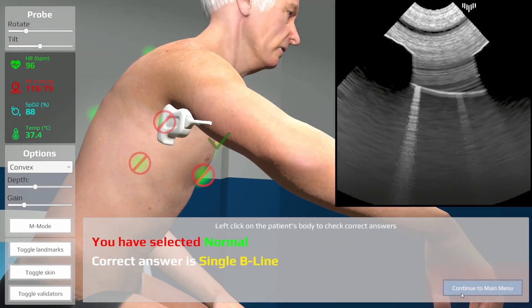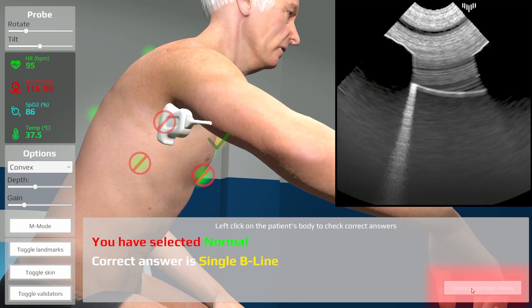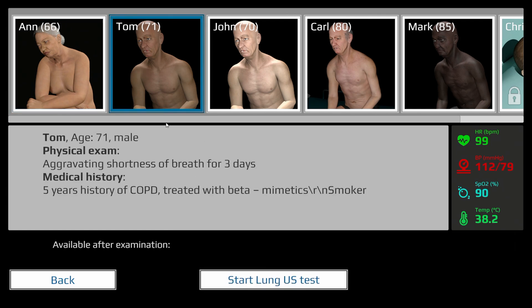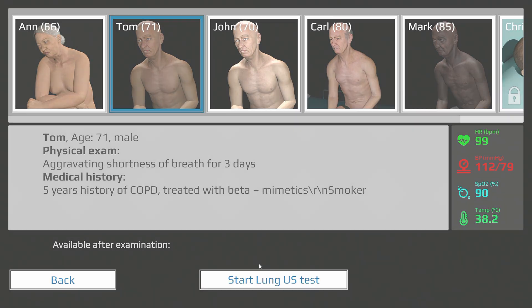You can then come back to the main menu and select the same or another patient. Good or bad, give us your feedback — we've worked hard to make it perfect.